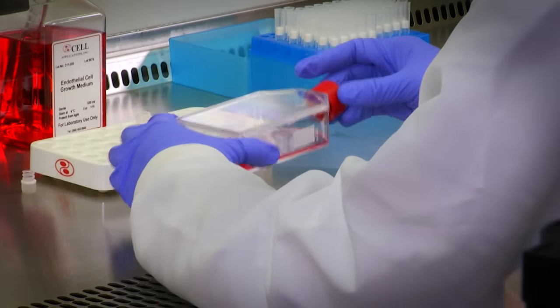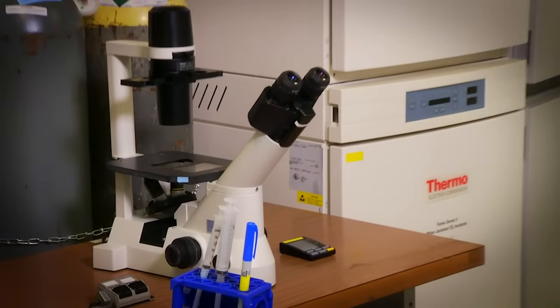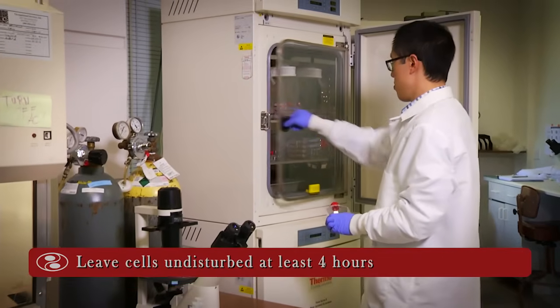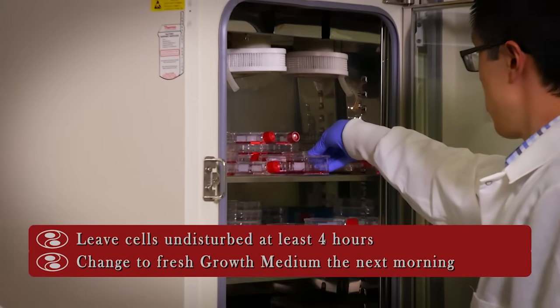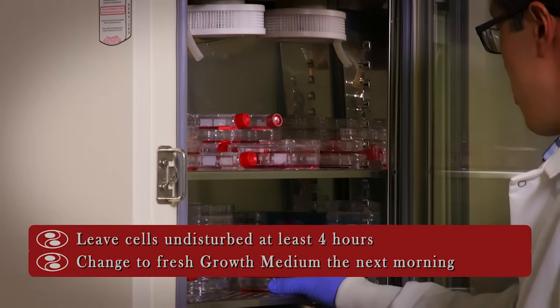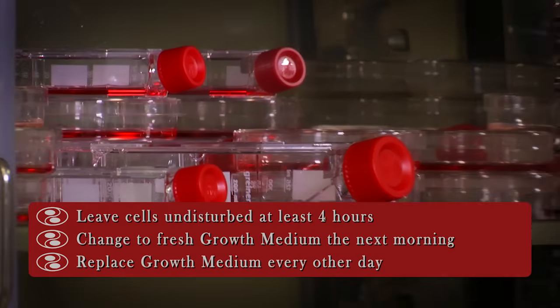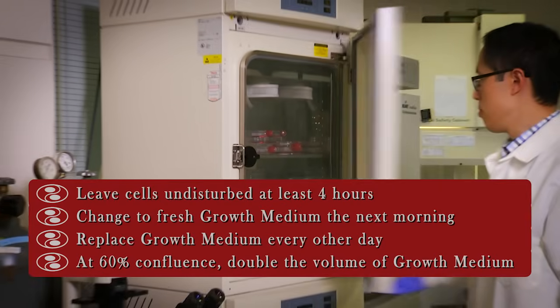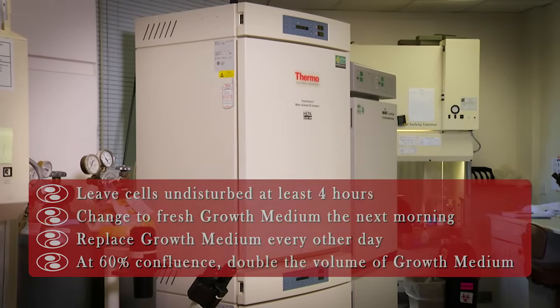Loosen the cap to allow gas exchange and place the T75 flask in the incubator. For best results, do not disturb the culture for at least 4 hours. Change to fresh growth medium after 4 hours or the next morning to remove all traces of cryoprotectant. Change growth medium every other day until the cells reach 60% confluency, and double the growth medium volume when the culture is greater than 60% confluent or for weekend feeding.